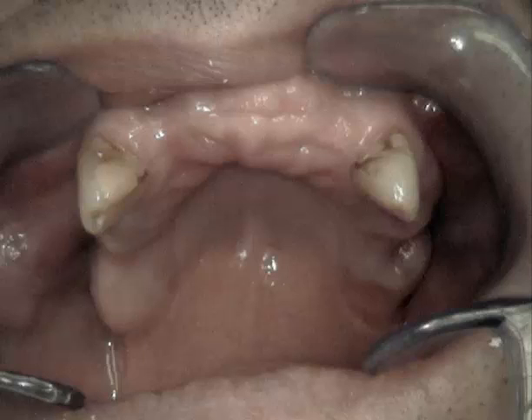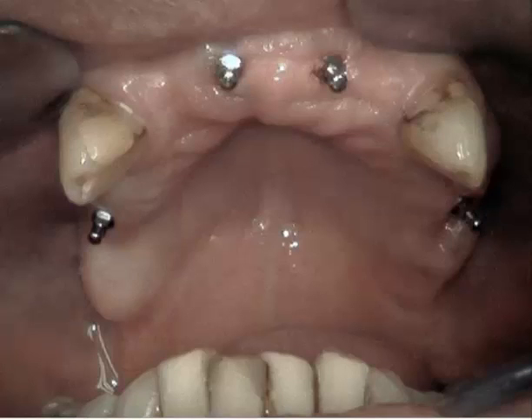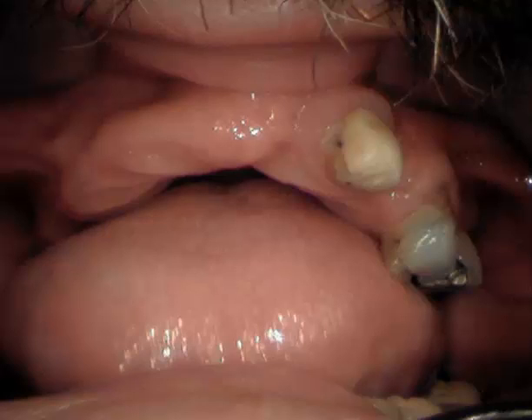In a case such as this, dentists would normally consider extracting those teeth and making a full upper denture. However, with the use of mini implants, we can place a few implants in the upper jaw and create a non-removable solution — porcelain teeth all the way around from one side of the upper jaw to the other, completely removing the need for any dentures.